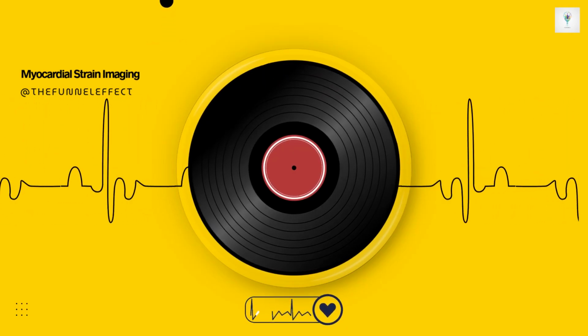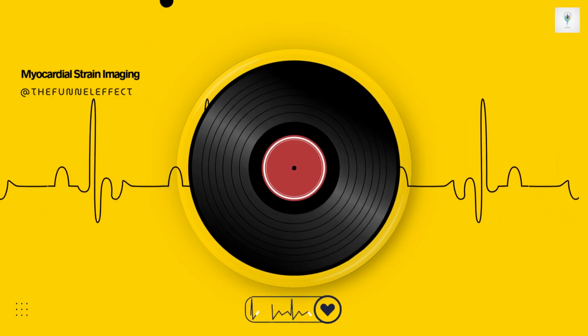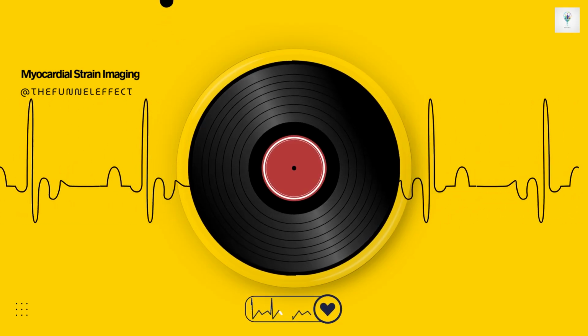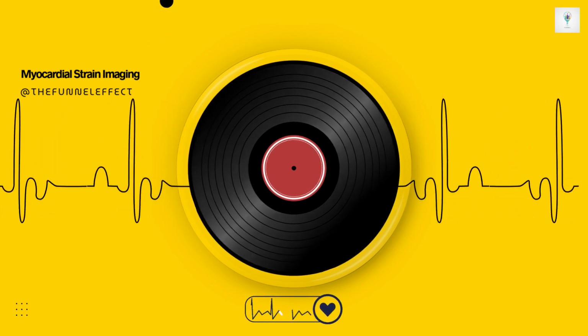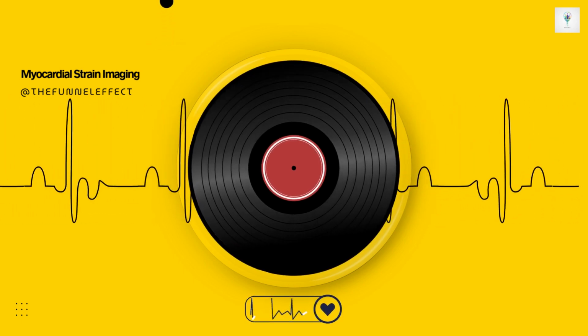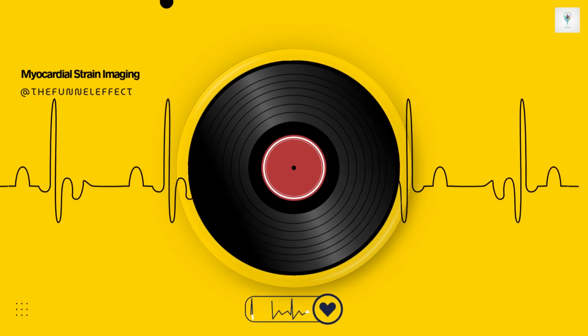Right. Plus, strain metrics aren't just for systole, the contraction phase. They help us assess diastolic performance, the relaxation phase, too, and we can apply these techniques to all the heart chambers, the left atrium, the right ventricle, as well as the left ventricle. It gives us a much more complete functional picture of the entire heart.